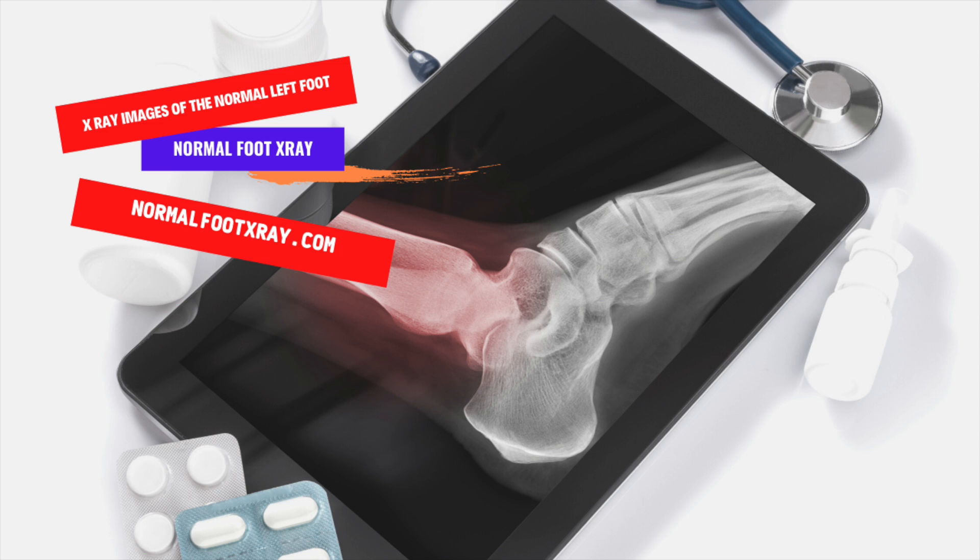X-ray images of the foot can be helpful in diagnosing many common foot disorders. These X-rays can help doctors identify the origin of painful symptoms. For example, they can reveal whether a fractured bone has healed properly, or if the bones are aligned correctly. Additionally, they can aid in surgery planning.